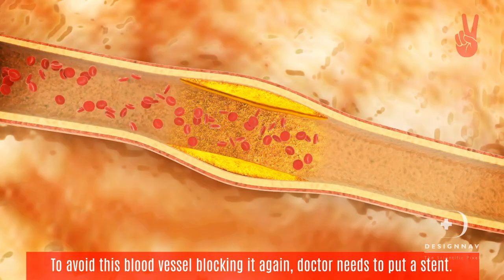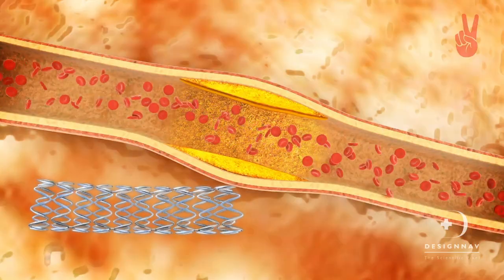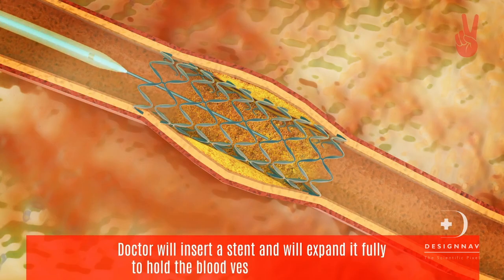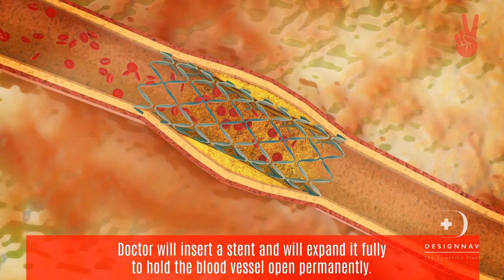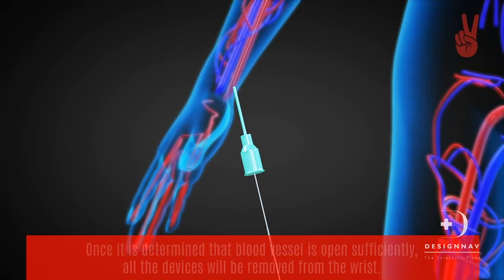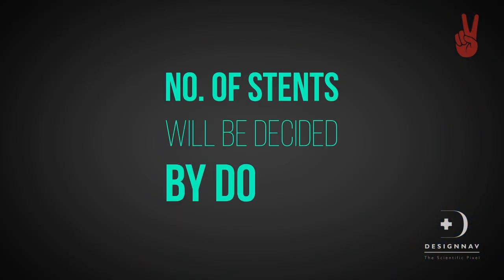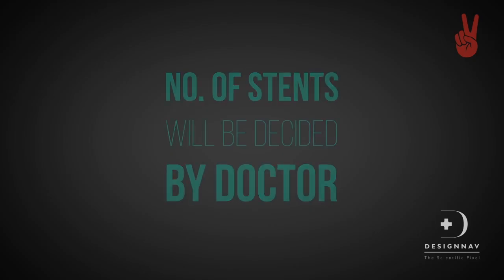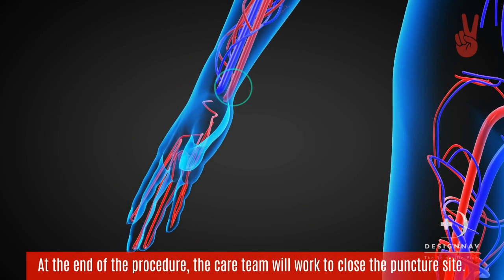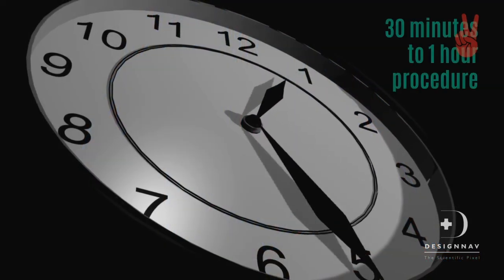Now, to avoid this blood vessel blocking again, the doctor needs to put in a stent. The doctor will insert a stent and will expand it fully to hold the blood vessel open permanently. Once it is determined that the blood vessel is open sufficiently, all the devices will be removed from the wrist. The number of stents will be decided by the doctor as per the number of blockages in the blood vessels of the heart. At the end of the procedure, the care team will work to close the puncture site where the catheter was inserted. This procedure lasts for 30 minutes to 1 hour.